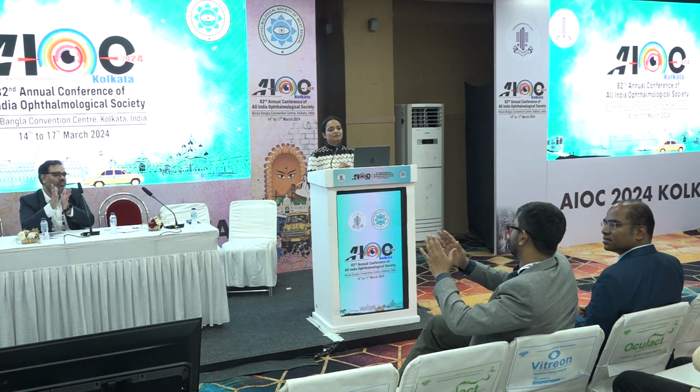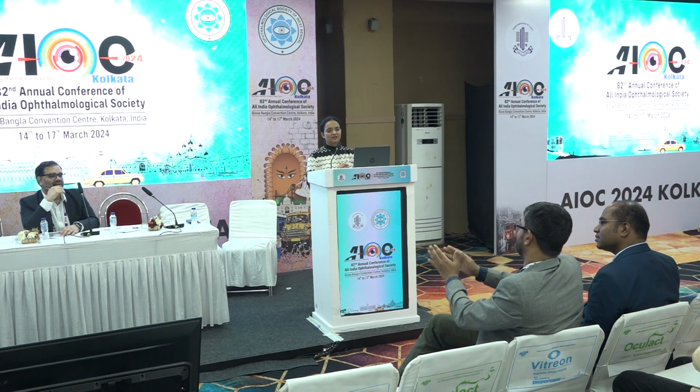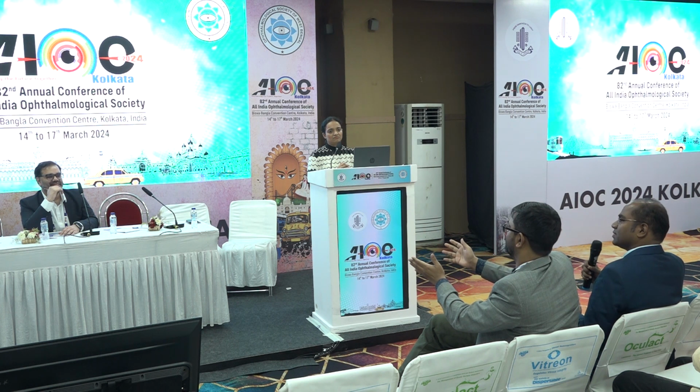So would you have done what you advised me to do at the first go? Would you go limbally in such a case? It would be safer to go more limbally in all these sorts of cases, just to see whether we can open the anterior part. If you're thinking it's an RD, you should still go ahead limbally and do the anterior PVR to be opened. If the other eye doesn't have any peripheral retinal degenerations, why would this? So then you start suspecting that I am dealing with something which is PFV.